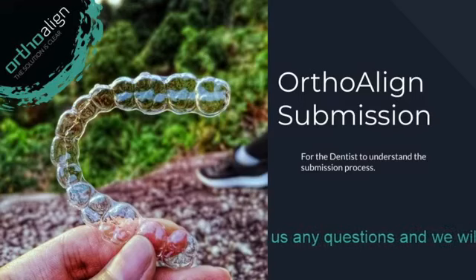Okay, so very important, inspect the impression, look at the impression, study the impression, and see how you can identify stretchings, how you identify layerings. And normally layering is the most common when we use the heavy and light body, right? So when we put on the next material to retake the impression to get the higher detail, if we don't insert the impression all the way in properly, then you're going to get layering, and layering is definitely going to be rejected because it's not accurate anymore. The fitting is going to be affected.